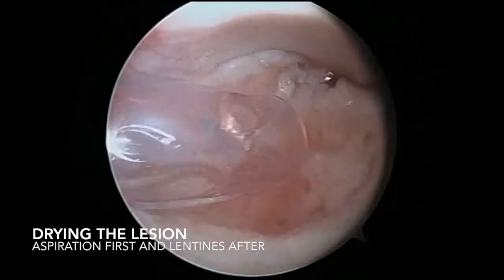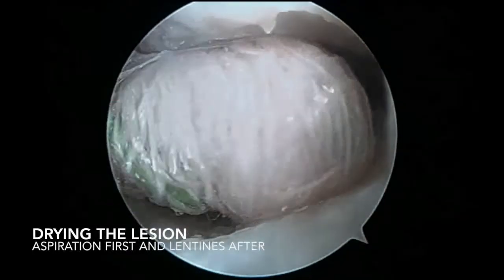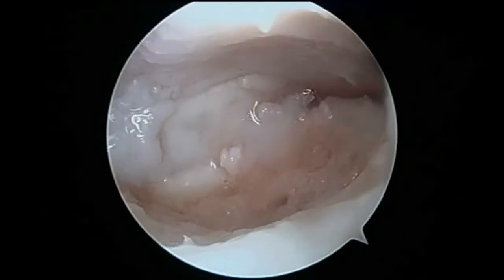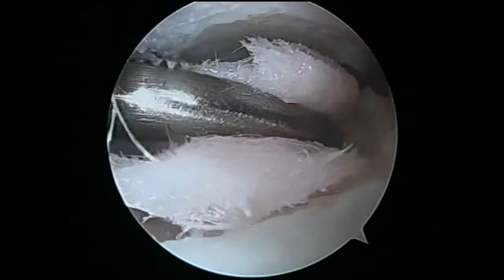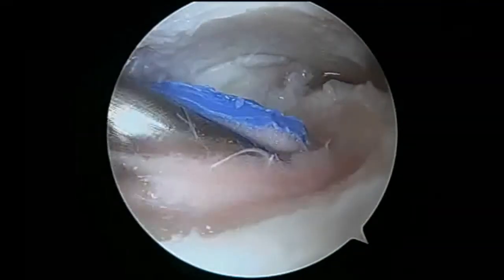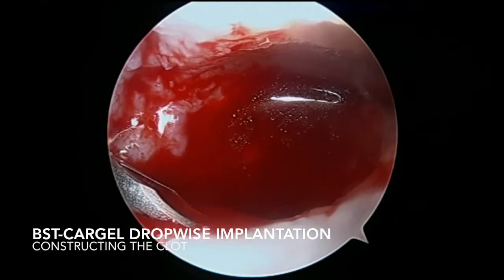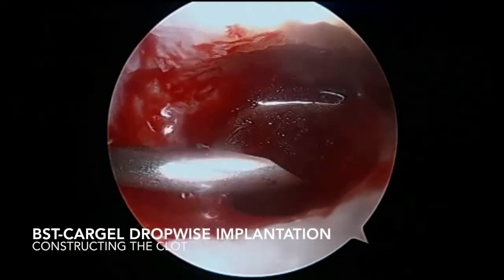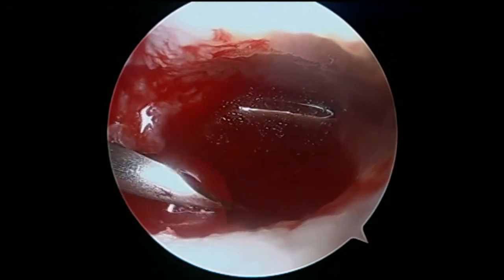After that, we proceed to dry the lesion, stopping the water pump and aspiration. Then, through a small cannula, we introduce gauze to directly dry the lesion as much as possible. When it is done, we proceed to implant drop-wise the BST-CarGel into the lesion area using a 16G needle. The objective is to construct the clot covering all subchondral defects of the talus.